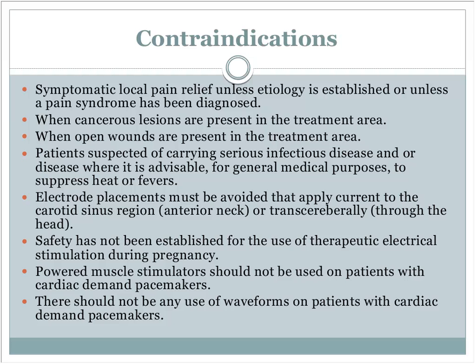Infectious diseases, because you don't want to increase blood flow and thereby spread the infectious disease throughout their body. You've got to be careful, obviously, about your HIPAA precautions and cross-contaminating to other people. If they're in a contact isolation room and you bring the eStim unit in there, you need to really clean that thing off before you bring it to somebody else who's not infected. Probably safer to not be doing it in the first place.